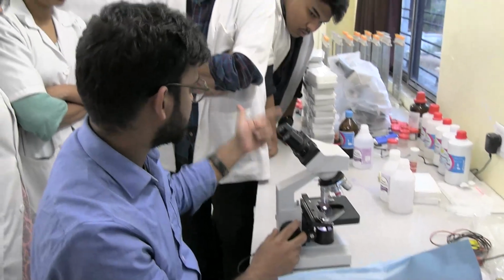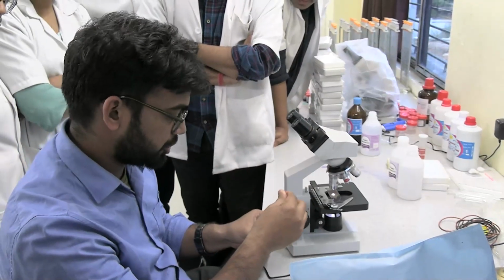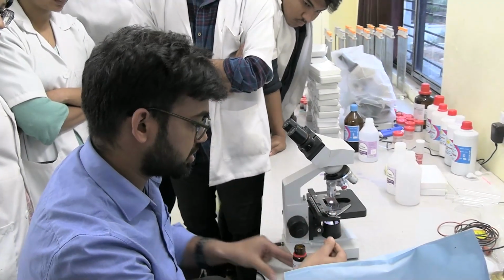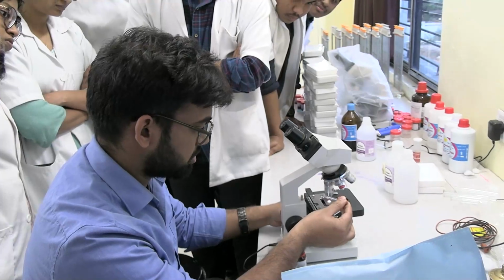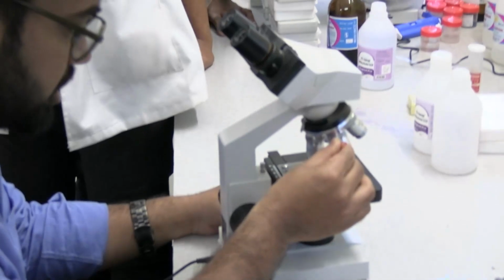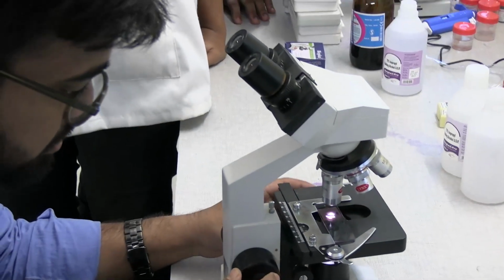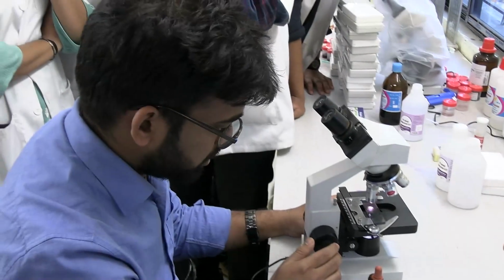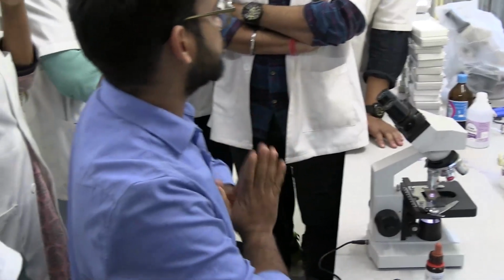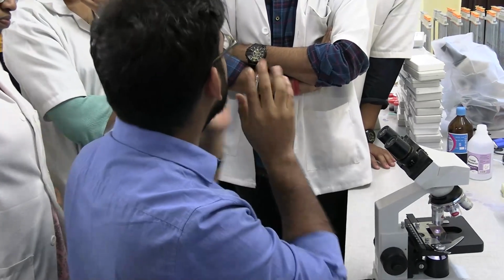Bring me one immersion oil. Now I am going to place how many drops? Of course, one or two drops. Why do we use immersion oil? To match the refractive index, so that the light can travel directly from one medium to another, straight to our eye.